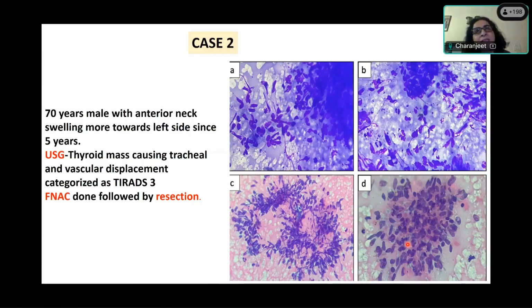So one is anaplastic, or which is the other thyroid carcinoma which can also have spindle-shaped cells and amyloid? What is that called? Medullary thyroid carcinoma. Okay, third, can you think of anything else? Angiosarcoma. Okay. Somebody is also calling it a granuloma. Granuloma in the thyroid. Okay. Anything else?